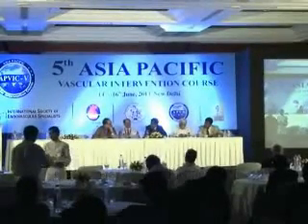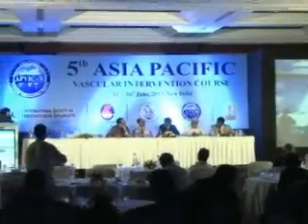Since the speaker has 3 minutes left, any questions, please, for the presenter? Very nice presentation, Doctor. I saw the complications. Recently, we see a lot about endovenous heat-induced thrombosis. Have you come across thrombosis after doing laser, endovenous heat-induced thrombosis after laser and radiofrequency ablation?